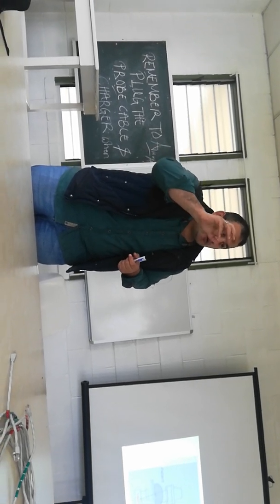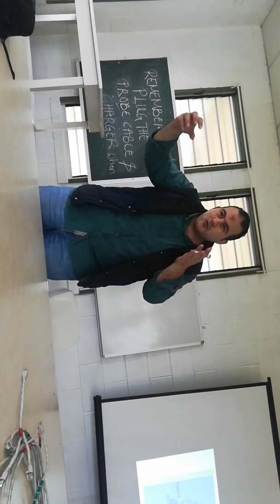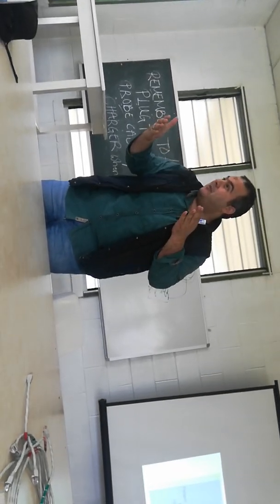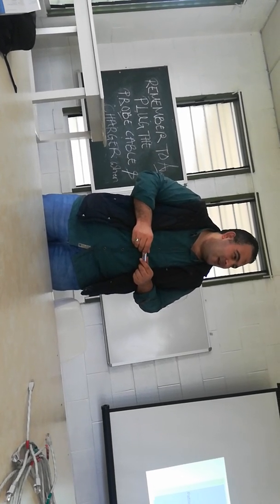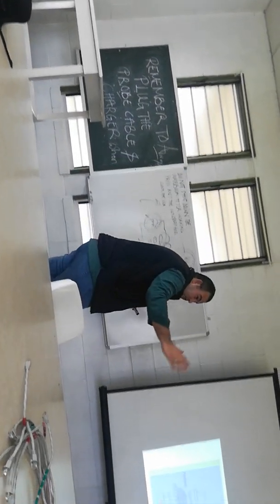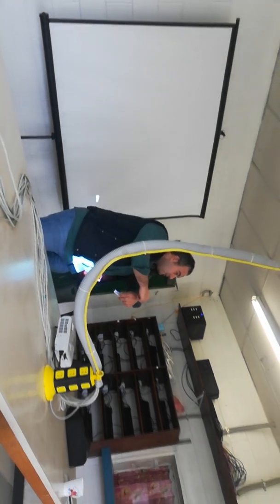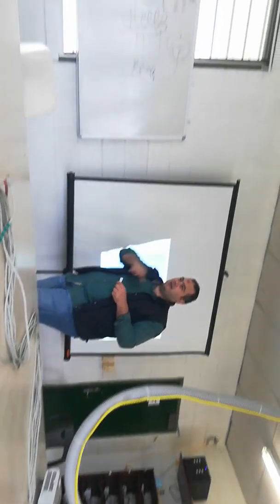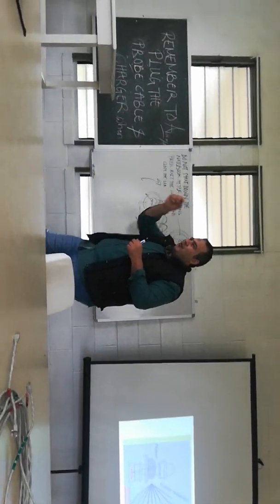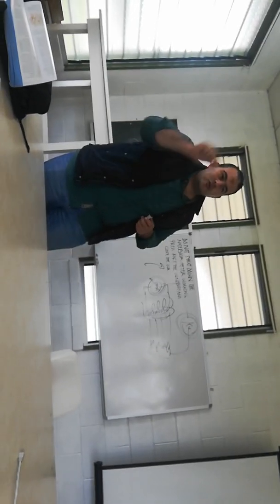These photons have no ability to blacken the image, so you will see the bone in white color, because photons are absorbed, not penetrating. But if you find cracks or fractures, they penetrate, so it appears black because the photons are penetrating. So the image will be black in this region, and you can detect if there is a crack or fracture or not.